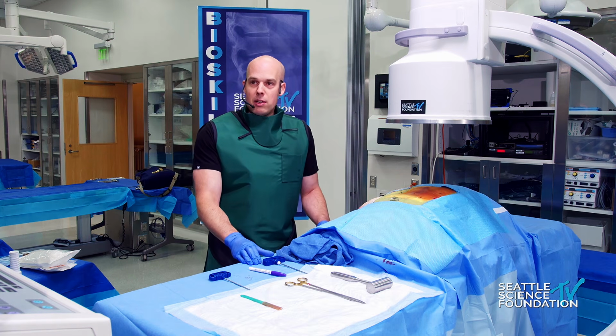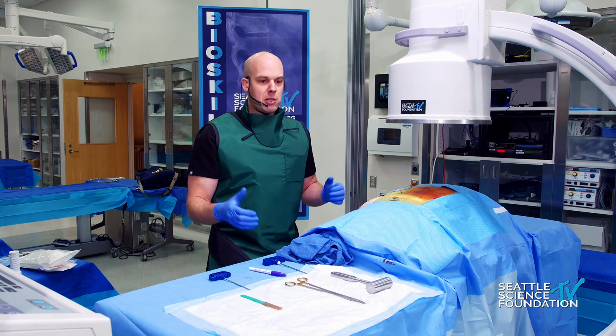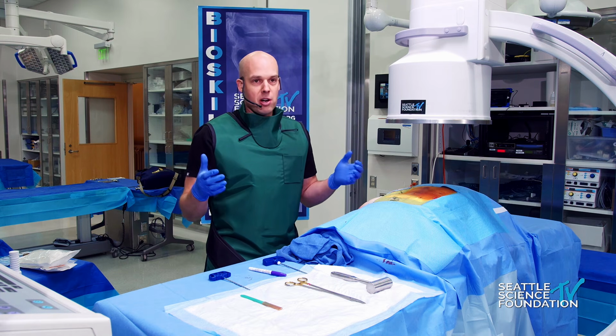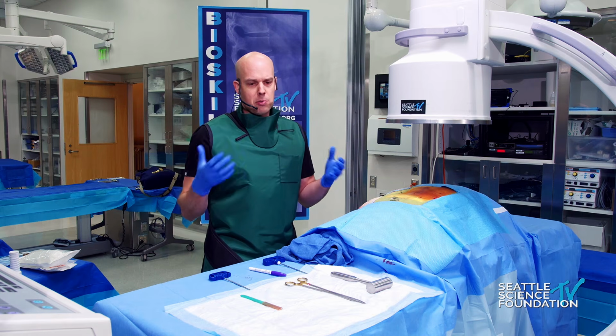So we'll show you a couple different ways to do this procedure, optimize the amount of cement within the vertebral body, and improve basically the outcome for this procedure. So first, who do we see for vertebral augmentation?